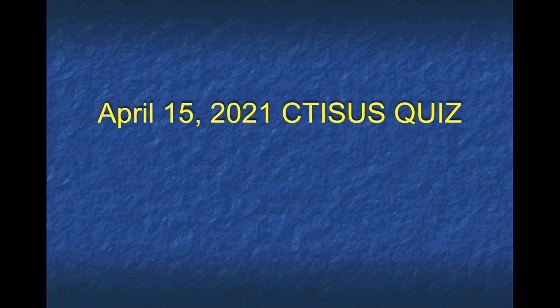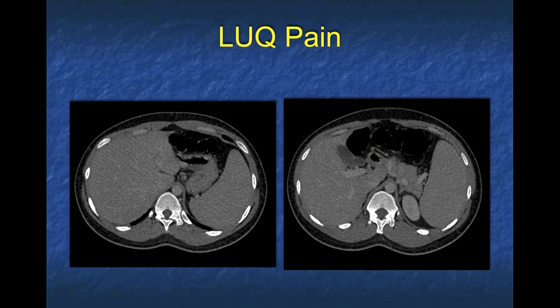Okay, what we're going to do is look at a bunch of cases. Hopefully we're going to show them to you correctly. Let's get started with that. Hopefully I can advance my slides. We're going to be looking at the spleen for the first few cases.